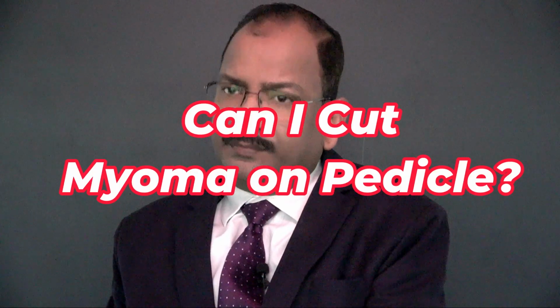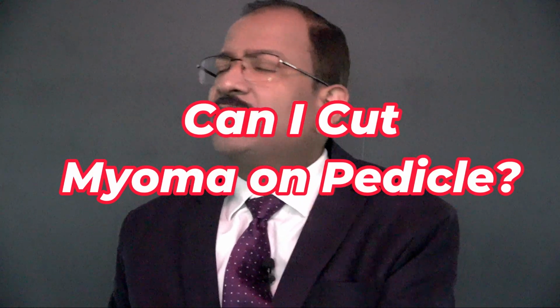For submucosal fibroid polyps, is it better to cut the pedicle? In a polyp you can cut the pedicle, even with scissors, cold scissors, or with the Collins knife or hook. But in a fibroid the pedicle will not be that narrow. It will be a couple of centimeters wide. It is not like a stalk. It is quite wide and very vascular. If you directly try to cut with the scissors, it may bleed. Moreover, a cut fibroid will take many months to degenerate and come out.